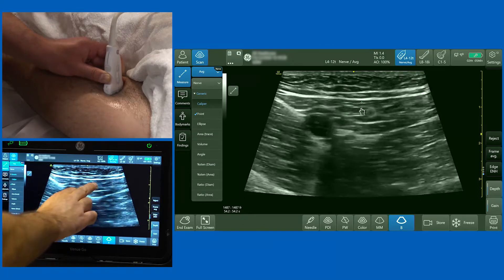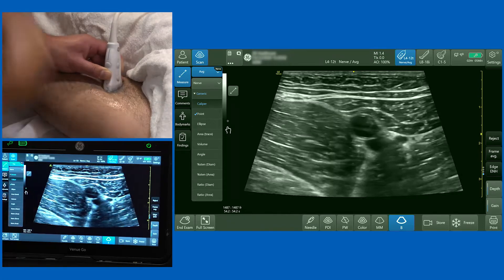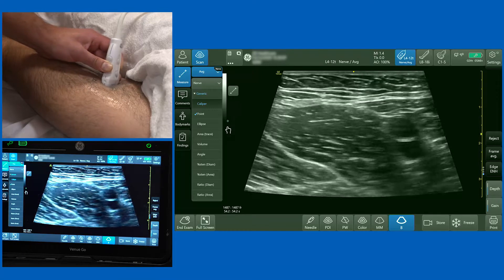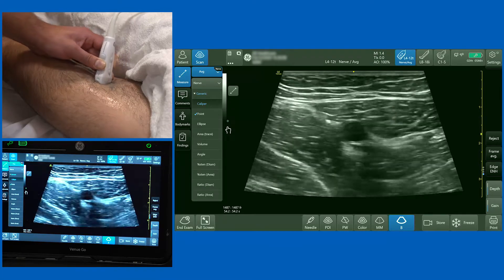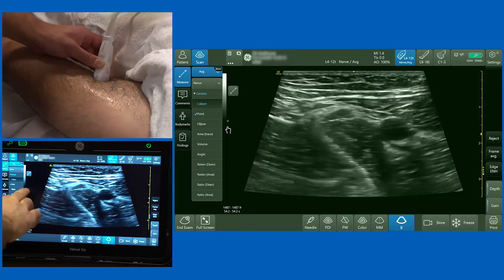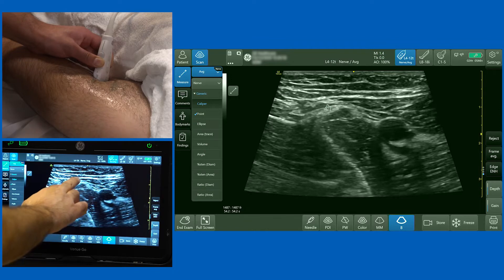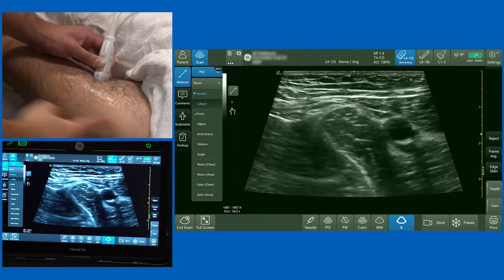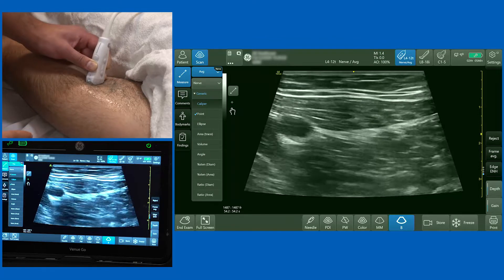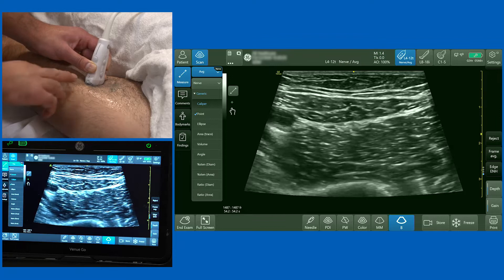I'm going to slide the probe medially so I can see the medial border of sartorius, and as I move down the leg I want to watch the medial border of sartorius and see where it meets the medial border of the adductor longus muscle — which happens there. At that point, the medial border of sartorius meets the medial border of adductor longus. Once I've identified that point, which looks like it's the midpoint of the thigh, I'm going to slide laterally, and at this point here this is a nice place to perform your adductor canal block.